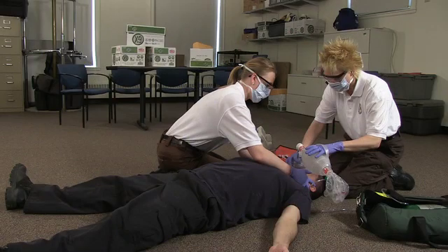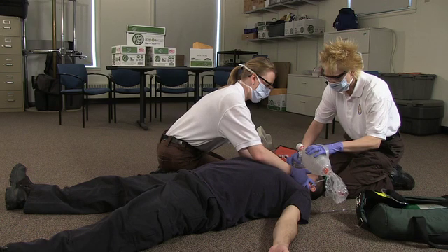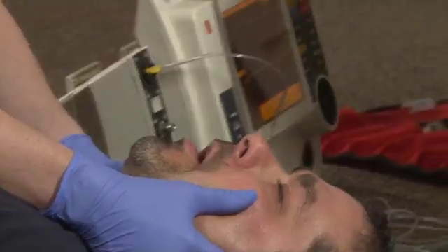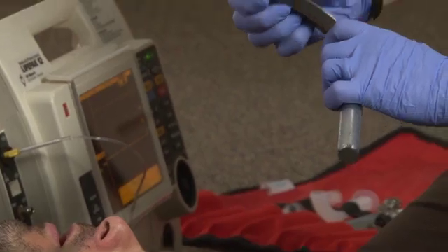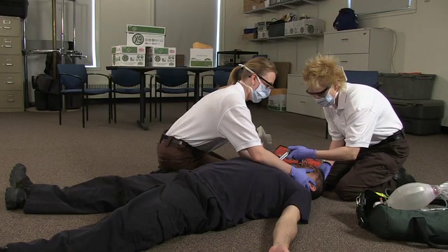Before the intubation is attempted, the patient is hyperoxygenated with 4 to 6 ventilations to achieve an oxygen saturation rate of 100%. The provider assumes a position above the patient's head. With the laryngoscope in the left hand, the patient's airway is opened and the blade is inserted into the mouth and behind the tongue.